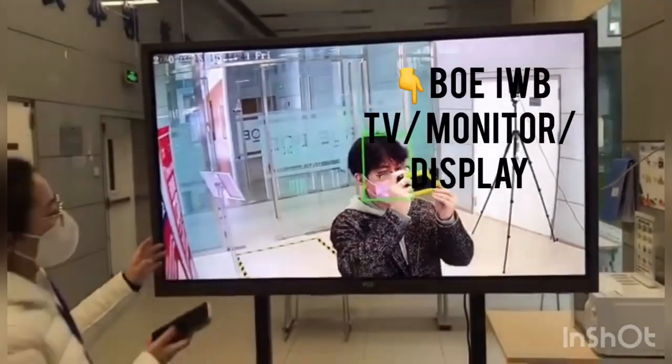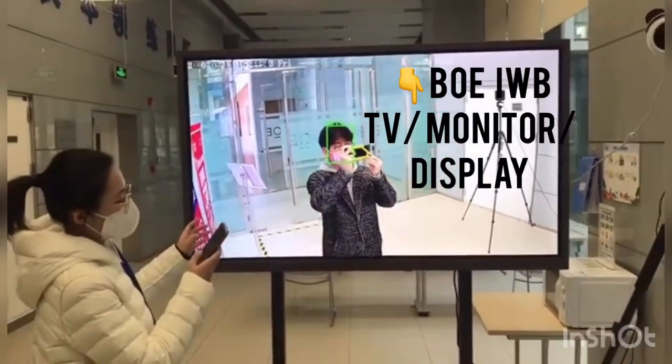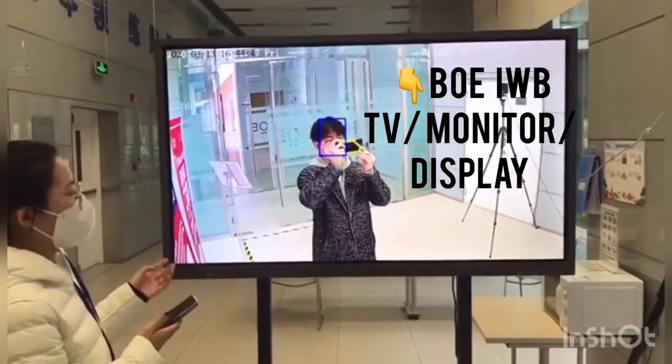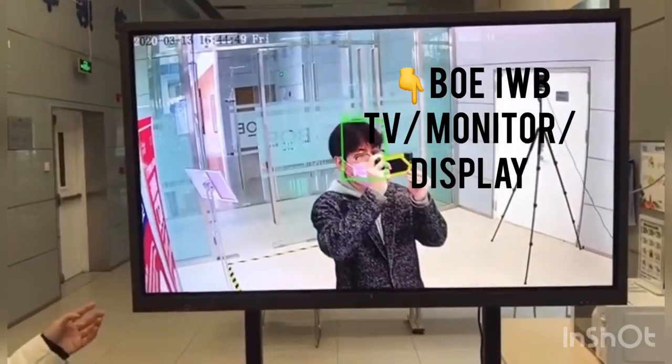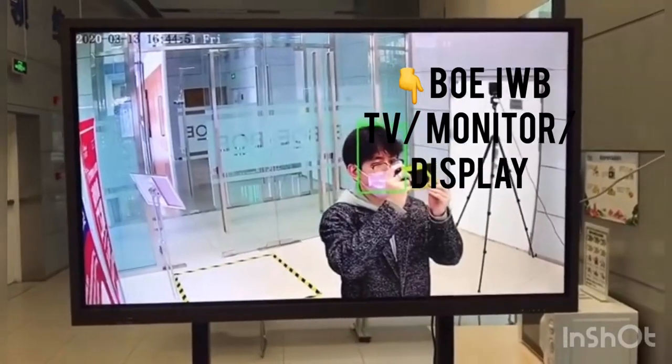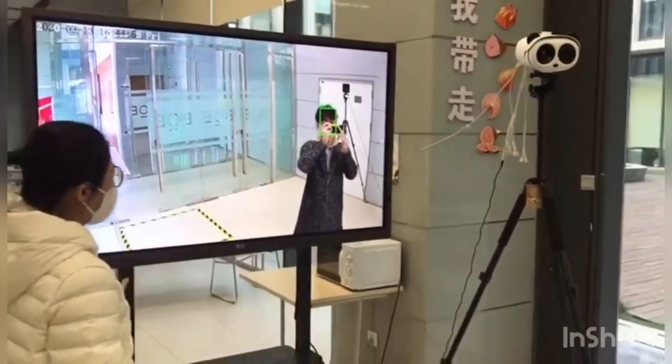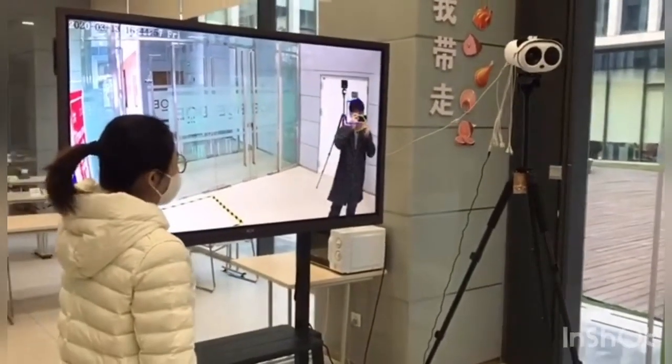Here is the terminal display equipment. We use the 65-inch IWB. You can also use all kinds of other device products like TV monitor and digital signage.